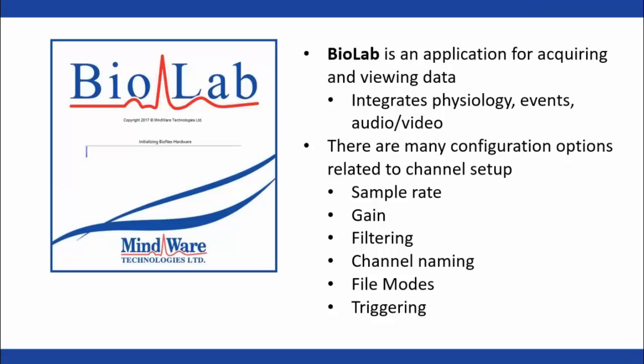We talked about some basic signal analysis and acquisition concepts such as sample rate and gain and filtering. We talked about the importance of naming your channels something meaningful for analysis purposes. We talked about the different file modes that are available in BioLab and how we can save data. And we also talked a little bit about triggering, which we're going to talk a little bit more about today as we talk about digital events.